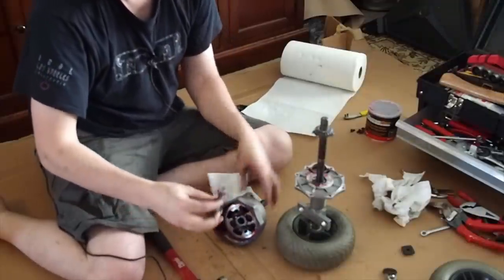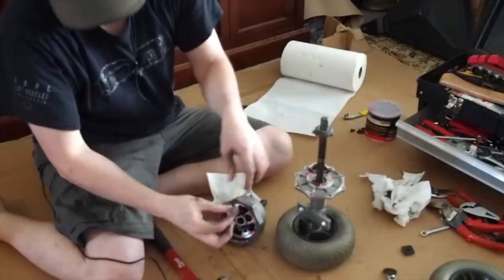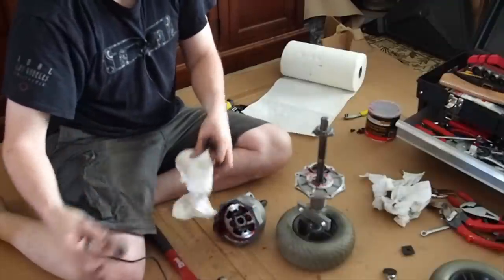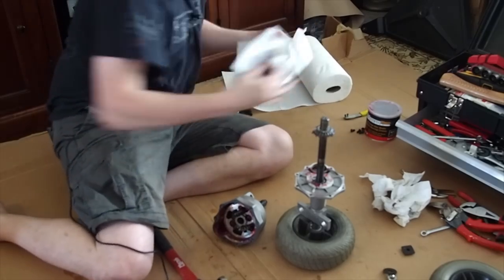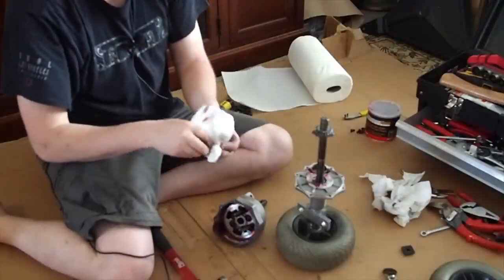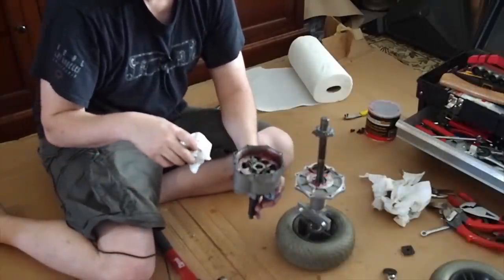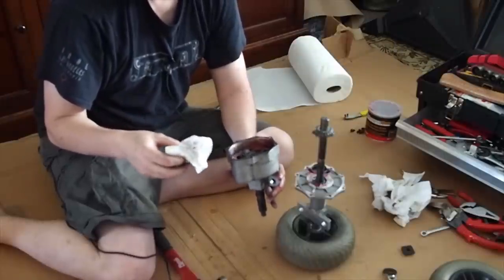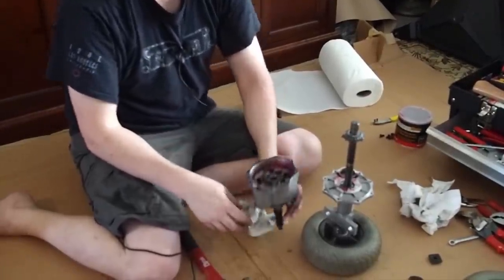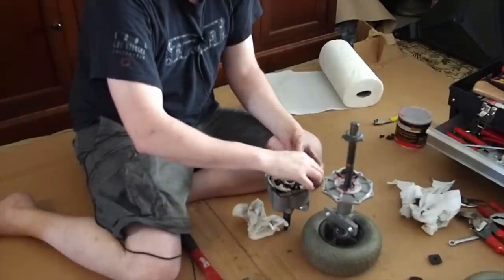Actually, sorry, I said the wrong thing. This is the bearing that was broken, not the big one, the small one. This is the skateboard bearing. I told you the big one. Anyway, this is the bearing that was broken, and I spent $20 on this little piece. I'm setting this aside on a piece of paper towel so it doesn't get too dirty. You don't want to put dirt inside of this. If you get dirt inside, it'll act like sandpaper and cause your gears to erode quicker.